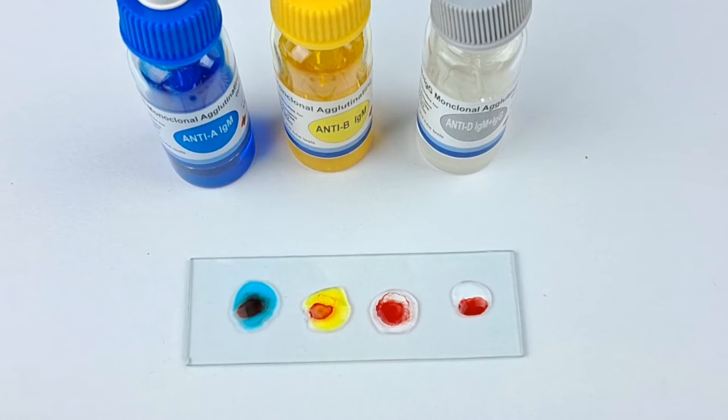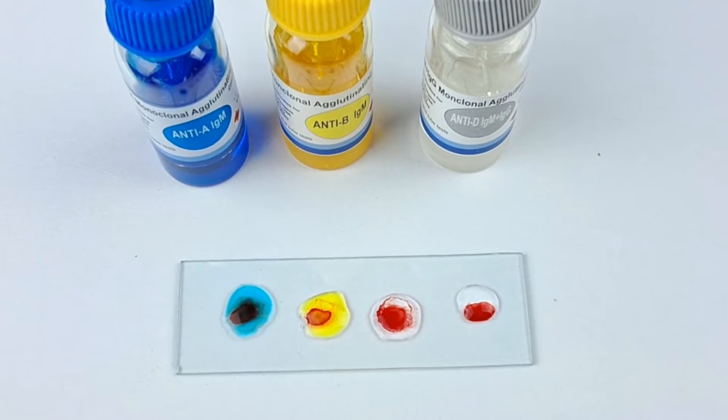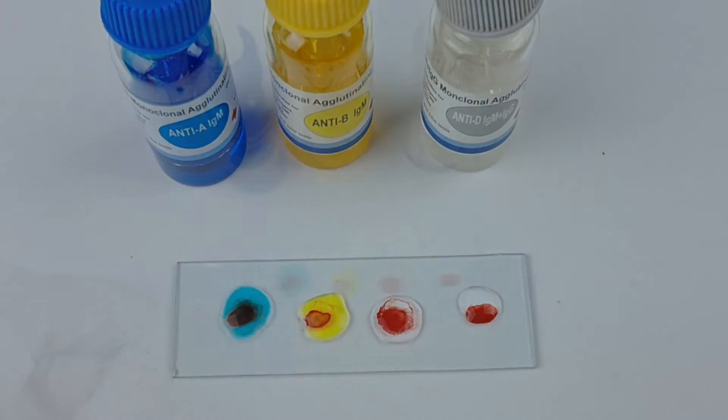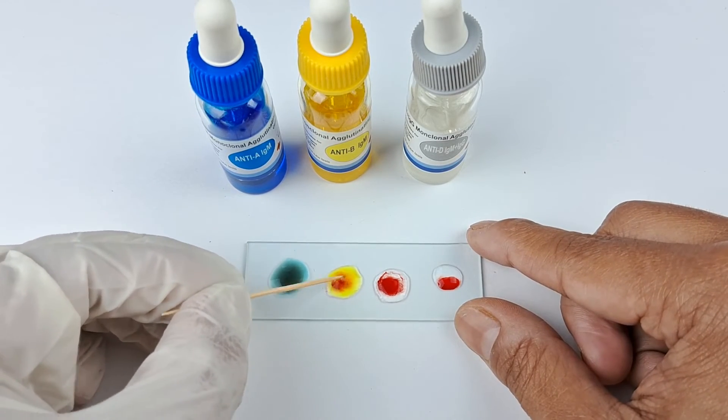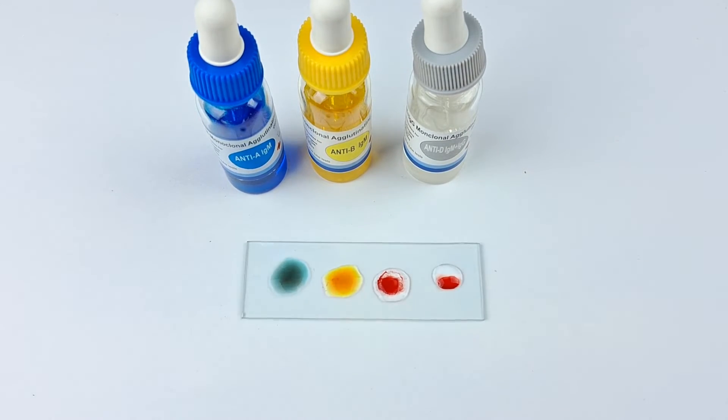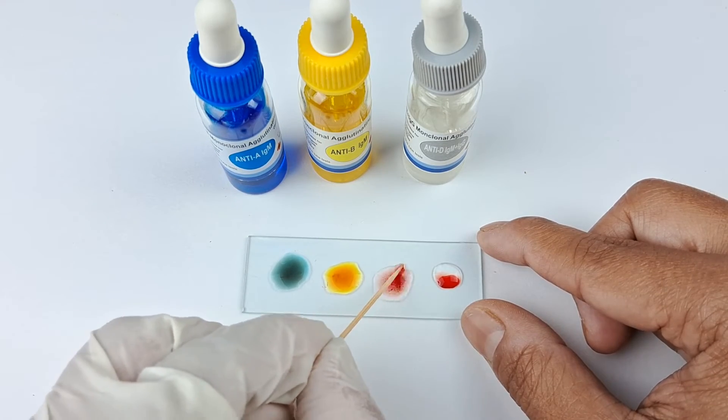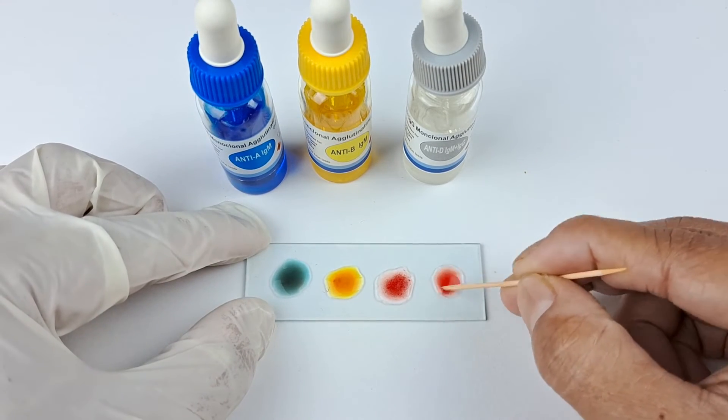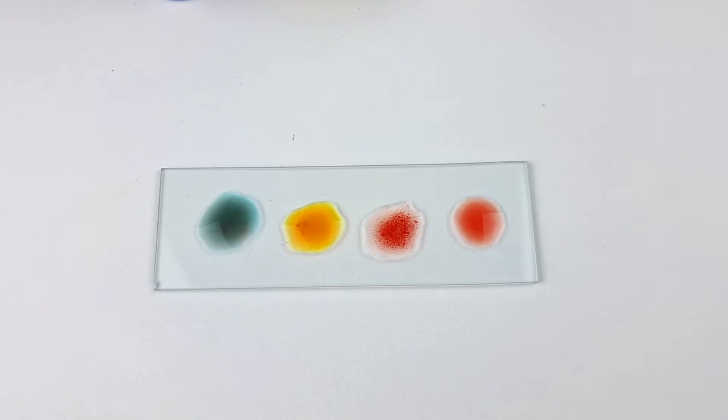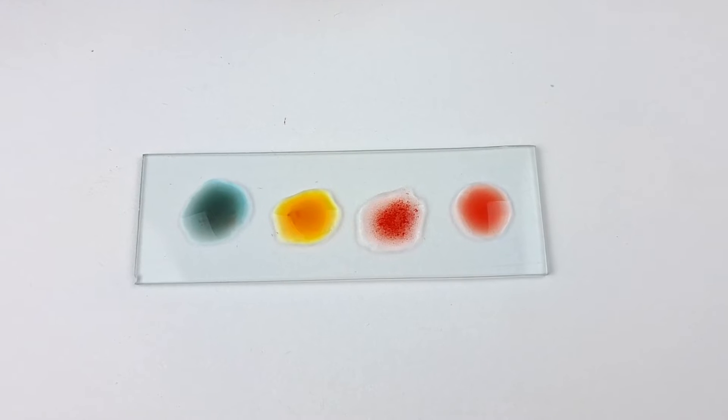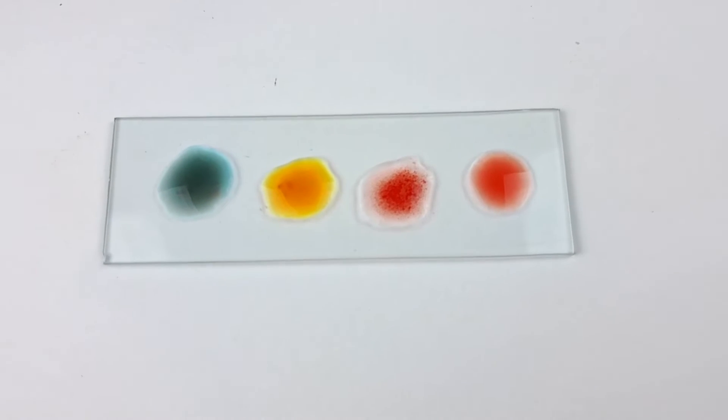Once the three antisera and normal saline have been added to the test and control blood samples, quickly and thoroughly mix the four blood drops individually using four different toothpicks or match sticks. Do not and never use the same mixing stick to mix all four drops. Once you have individually mixed all the reagent blood drops, leave the slide undisturbed for 30 seconds to a couple of minutes.